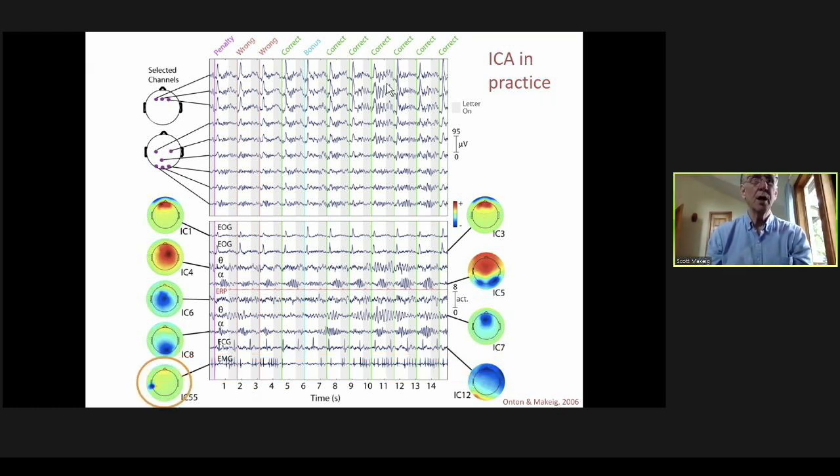Here is this scalp muscle, again, a post-auricular muscle with muscle spikes. Here is a subspace. Now the subjects seem to be blinking slowly after every trial. So rather than throw out the trials, you see the blinks are going all through the frontal channels of the data. But here ICA separates it out into an earlier and later phase of the blink and completely removes it from all the other source activities.